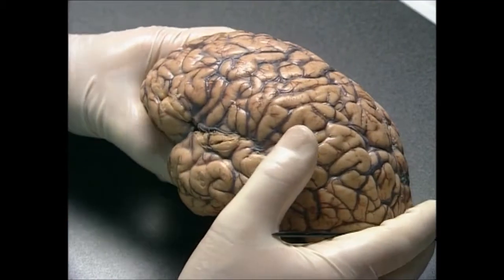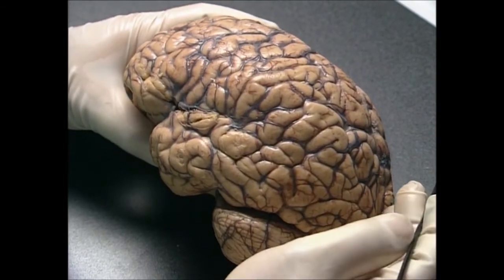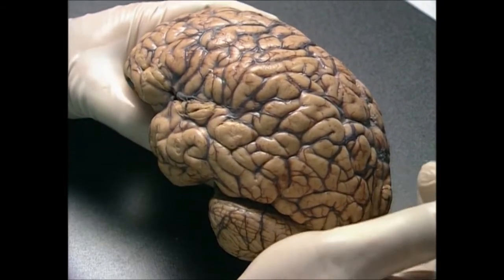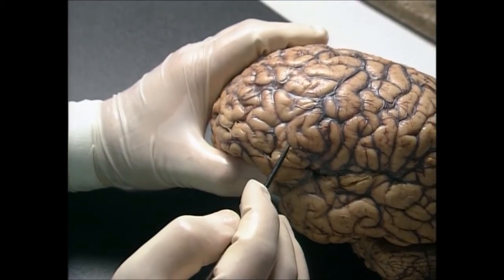One also has to notice whether there is any focal evidence of pathology, like an infarct or a hemorrhage. The other thing to examine is the appearance of the leptomeninges, whether they are cloudy or thickened. One could also have a general idea as to whether the gyri of the forebrain are edematous or not.